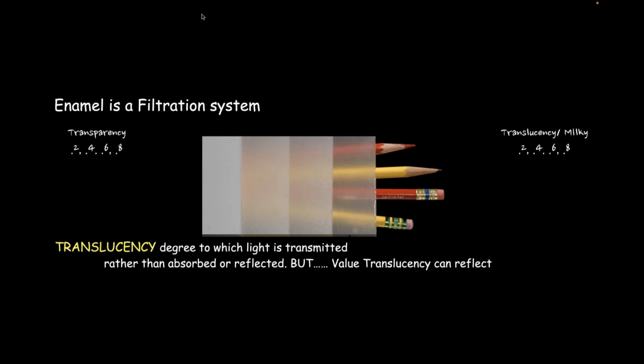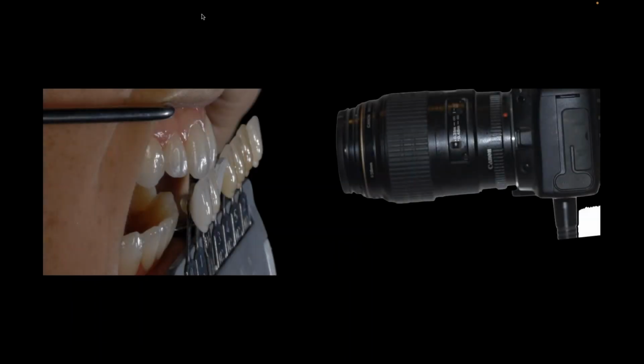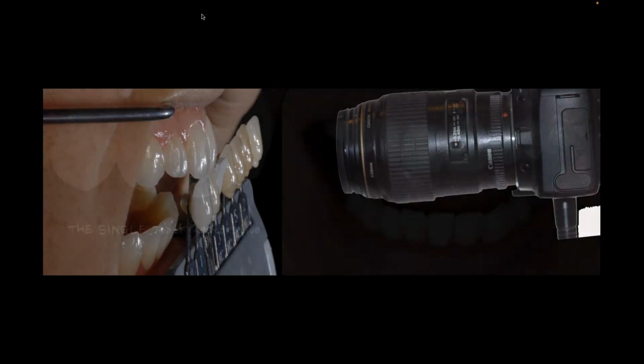If I have a very milky enamel, that surface is not really allowing me to see much of what's behind there. Whereas when I have the translucency, I'm getting what I see in the backside or the inside aspect of the tooth. So think of that little photo when you're trying to pick your shades next time. What is my enamel that I'm working through, and what is the value? I've already said to you the shade guide should be edge to edge, not overlapping the teeth.